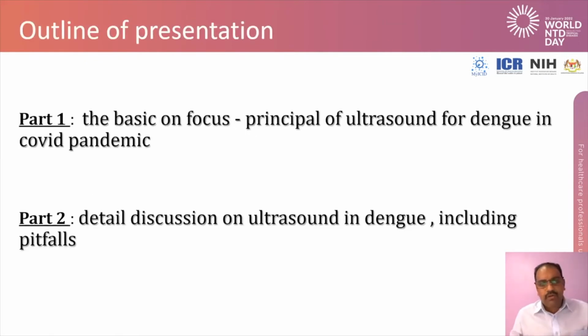So the outline of my presentation will be two parts. The first part, I will touch a little on the basics, the principle of ultrasound for dengue in COVID pandemic. Then once we have covered some of the basics, we will move on into a detailed discussion on dengue patients, and we also will look into some of the pitfalls and some evidence that we have in our latest guidelines.